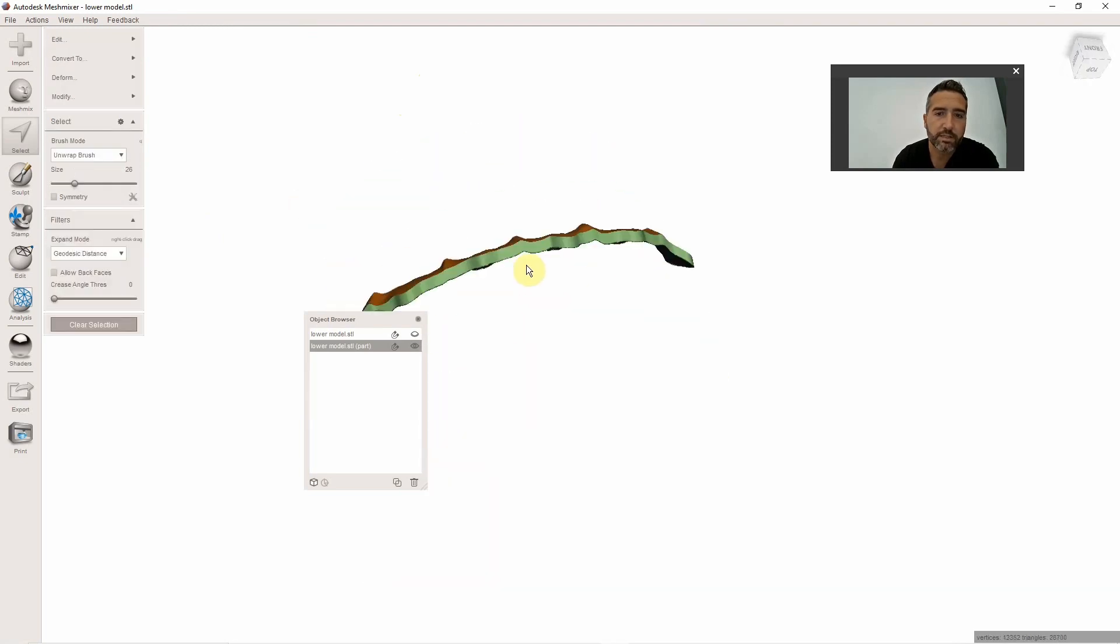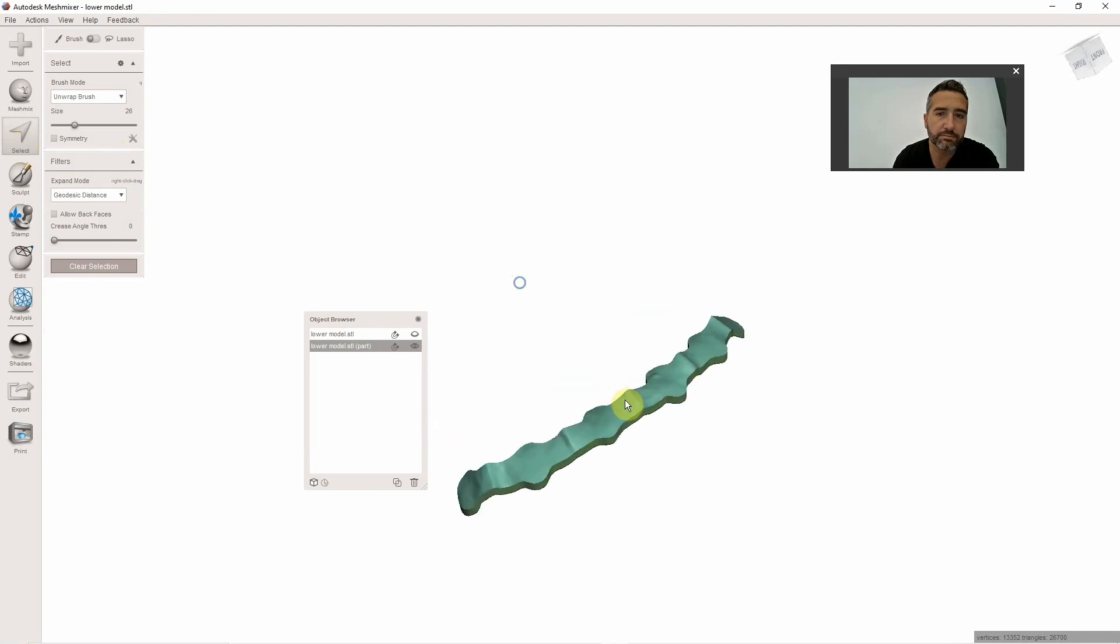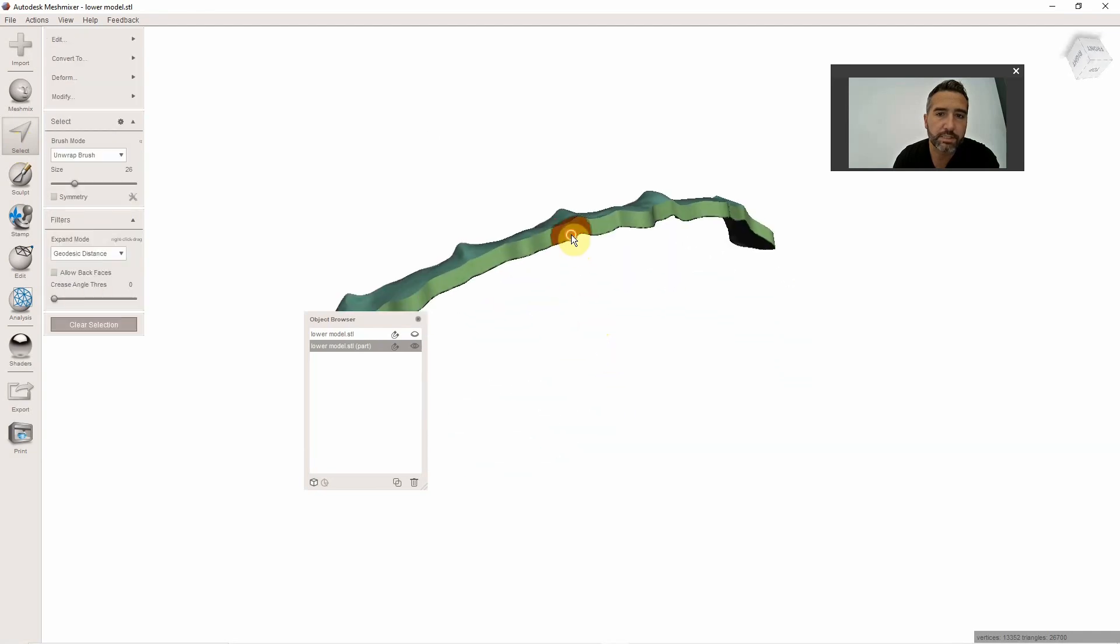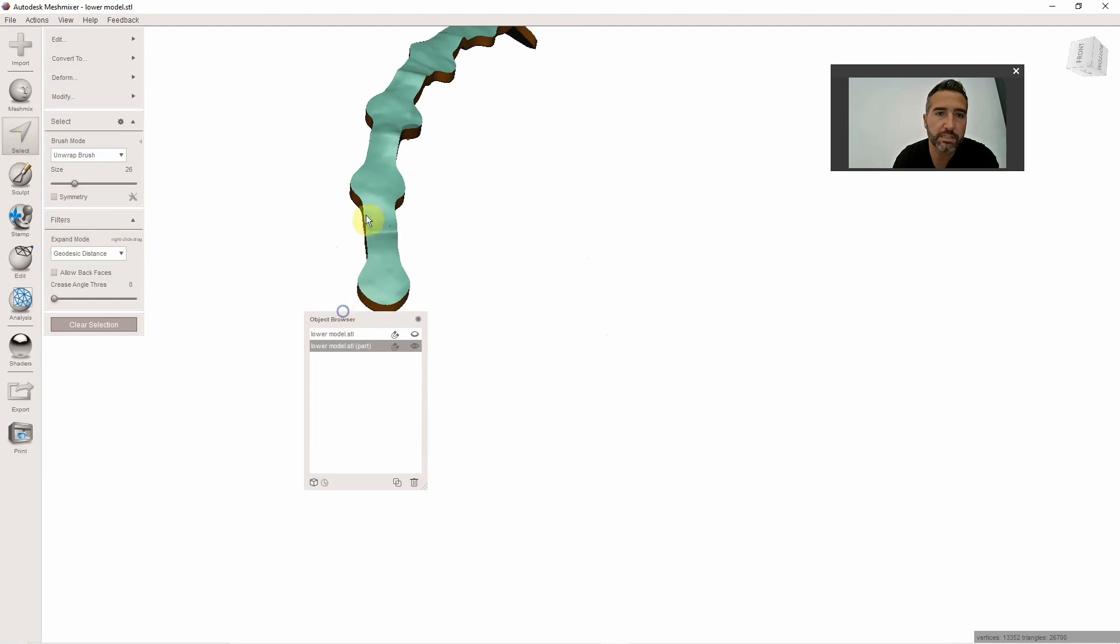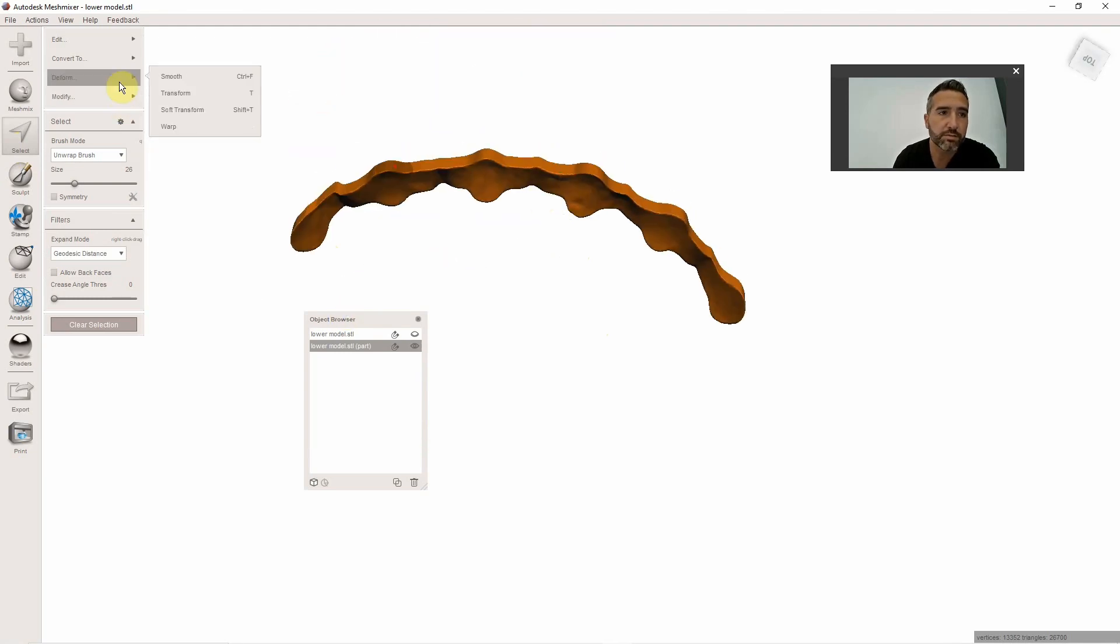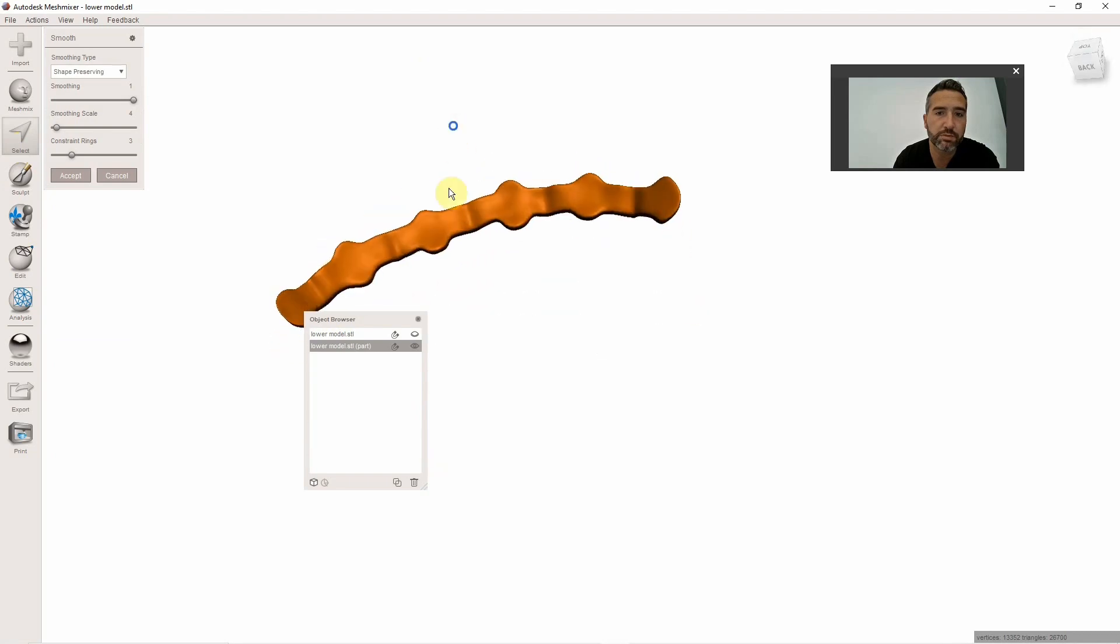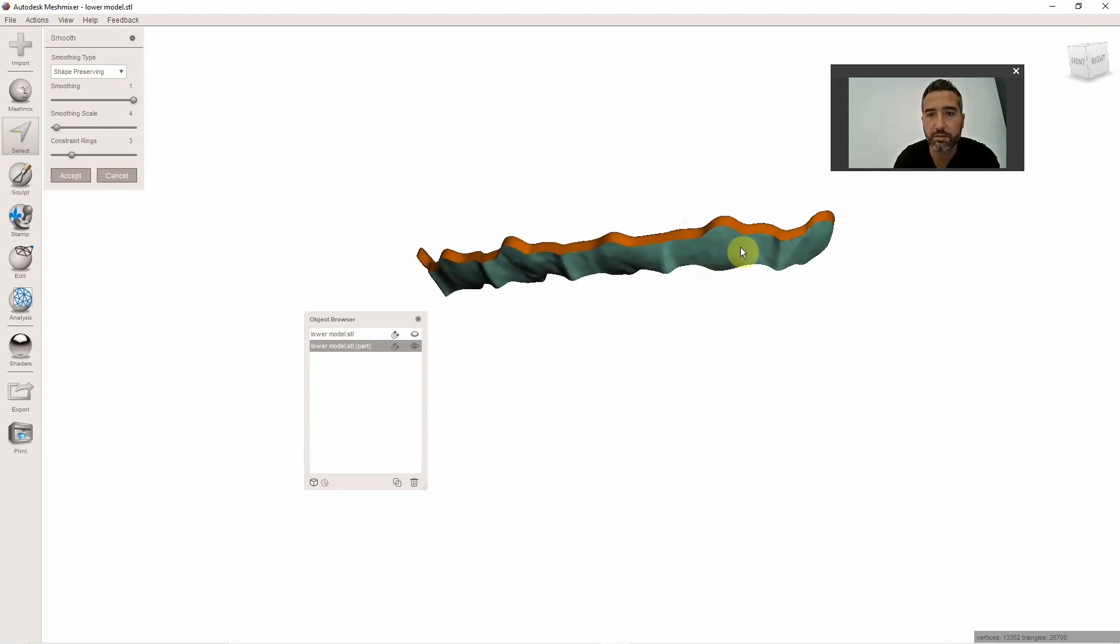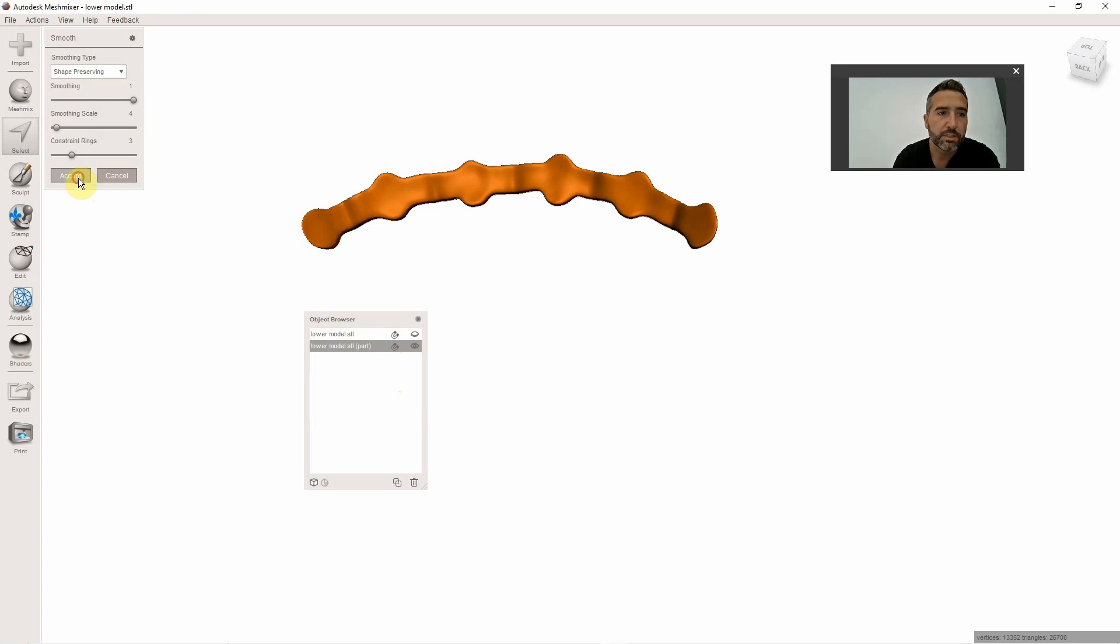Okay, then what I do is hit Select. I select this surface like this, but not the Intaglio fitting surface. And I go to Deform Smooth. That will smooth that whole entire surface without altering the fitting surface. And that is it.